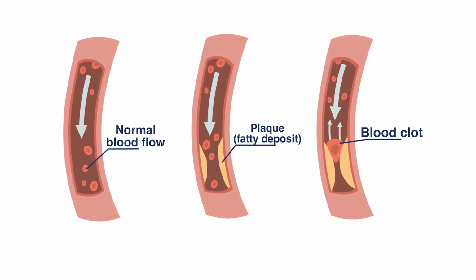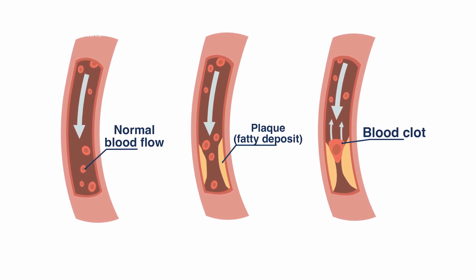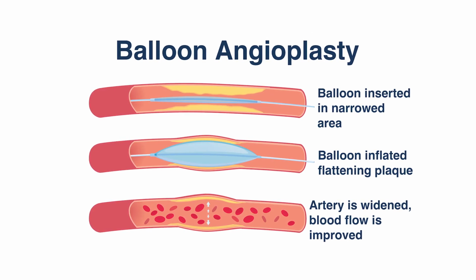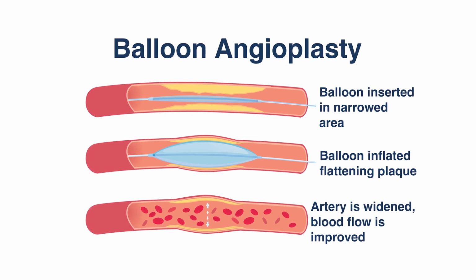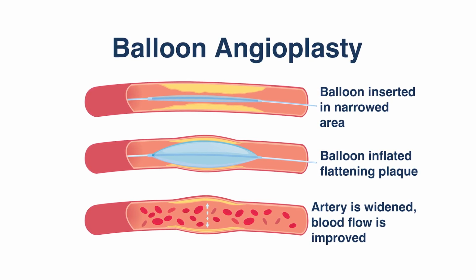So the blockage is evaluated by whoever's doing the procedure. Sometimes it's very obvious that it's a very critical blockage that needs to be addressed by endovascular means. Typically what that means is advancing a different catheter that is capable of doing an intervention, advancing a wire across the lesion to cross that area, then proceeding with a balloon to inflate that area and make some room to do things that we may need there afterwards.